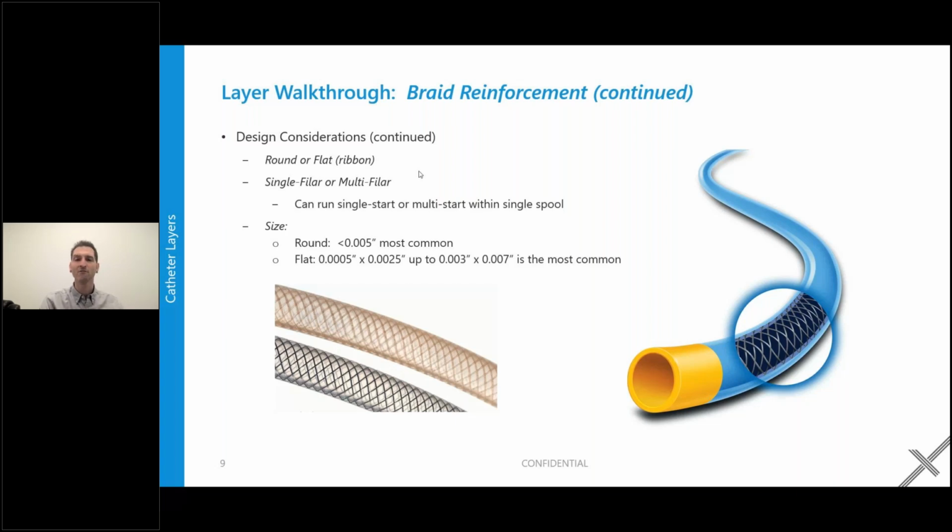And you'll have a lot more flexibility there because you have 3 independent wires stacked side by side. And so those can flex about each other. Not as commonly used, generally used for really high flexibility while still maintaining pretty good torque and axial rigidity. It's more complicated, it's more expensive, it's more time consuming, but it has its uses. We can do double start, triple start, quad start. There's a few different options there.